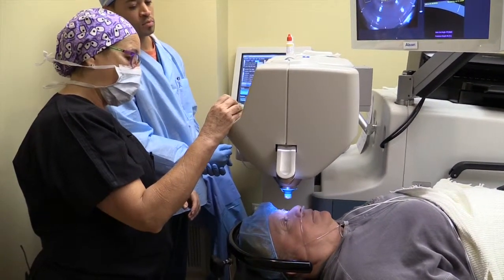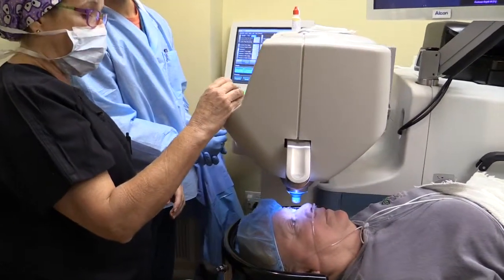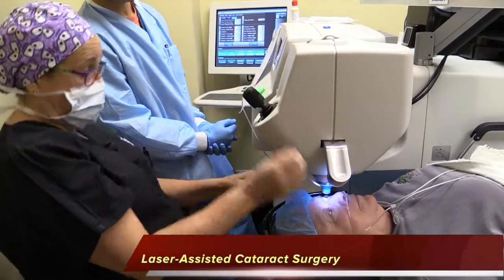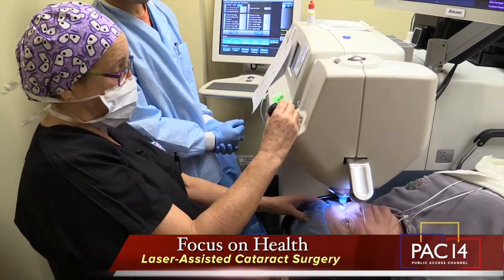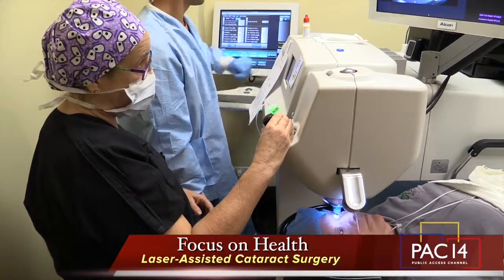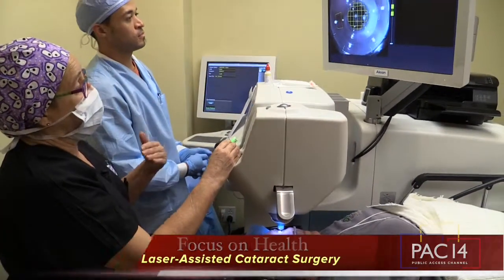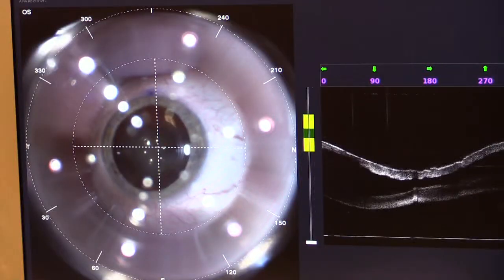Thank you. I think we're pretty good. Now, what I'm doing is aligning this, and I'm going to bring her head just a little bit because we want it aligned so we don't hit her nose. I'll ask our engineer to please bring this to focus, which this laser is now automatically assessing the depth and the focus right there as we do it.